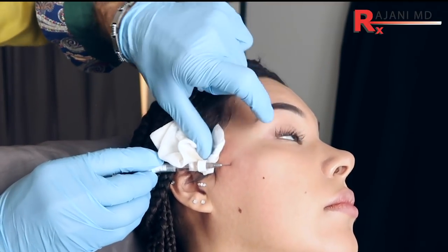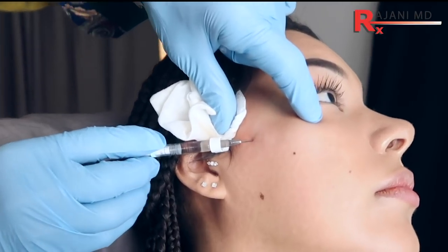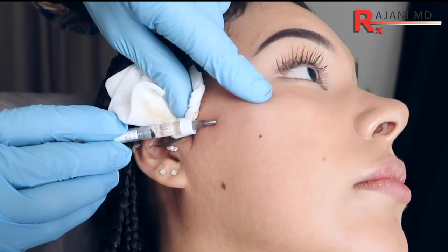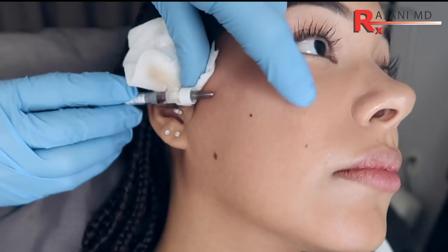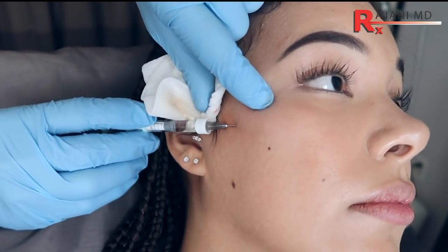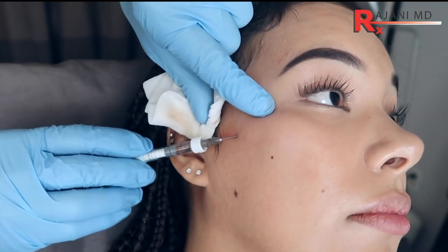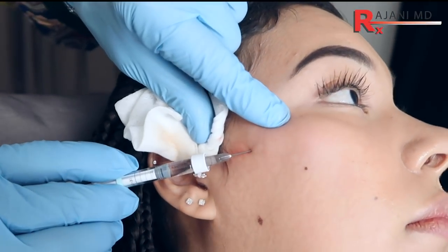Now I want to watch where I'm going. The lateral canthus — I know I want my high point here, my maximal light reflection. I'm using a two-inch cannula so I can reach that, and if I can't, I push the skin over so I don't have to make another opening. But if I needed to, I would come from the bottom and up — I don't need to because I can get where I want to be. This is a 22 gauge, so the flow is very quick and easy. Now I want to be a little more towards the apex and put a little bit of product there. I want to stay higher because she's young — we can stay higher and keep that high cheek and beauty.